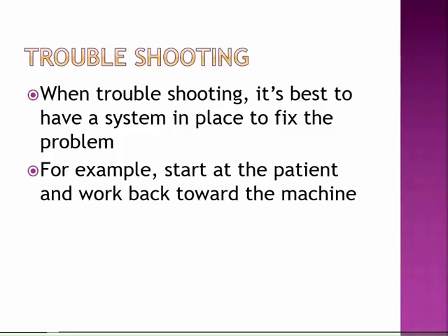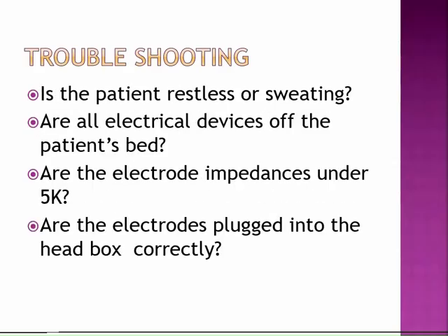If necessary, re-scrub it, re-clean the wire, reapply it, make sure there's enough paste, follow it back. Is it plugged in correctly? Is the head box plugged in? Is the cable connecting the head box to the amplifier secure? What is your patient doing? Are they restless? Are they sweating? Are they moving? Are they on their phone? What electrical devices are near them?